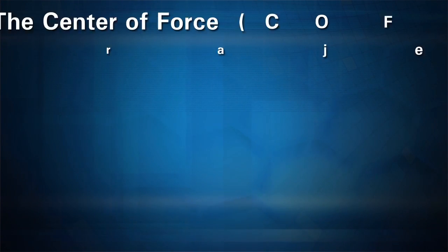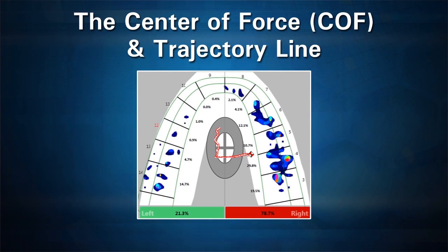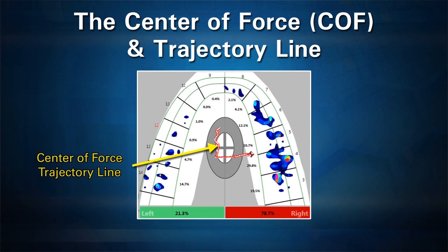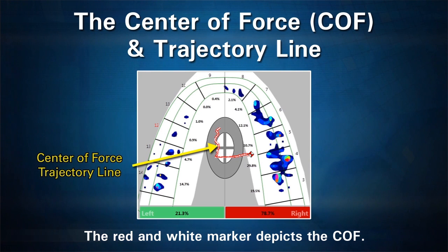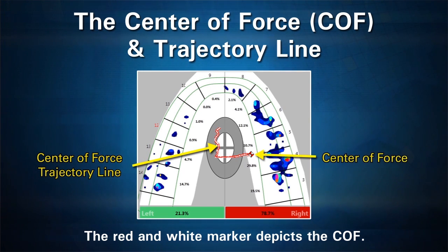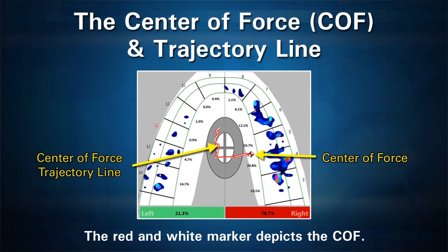For each recording or scan, T-Scan displays a center of force line which represents the force balance of the bite over time. This line is similar to the path of closure. The red and white center force marker represents that point in time during the closure sequence. This is essential for ensuring your patient has a well-balanced bite.